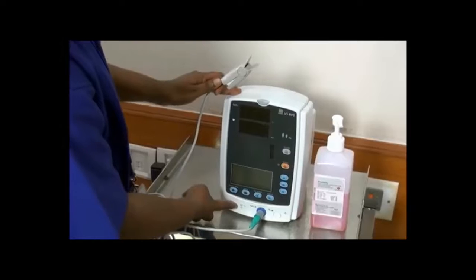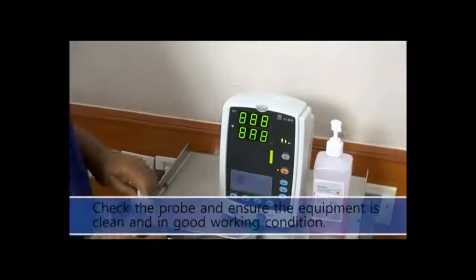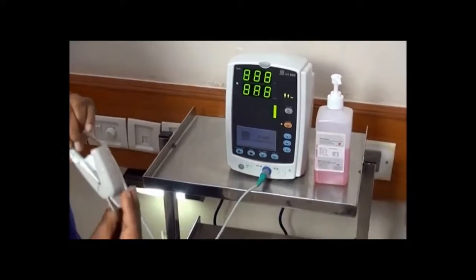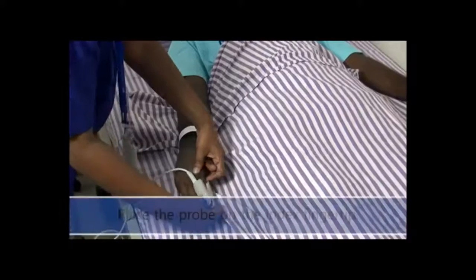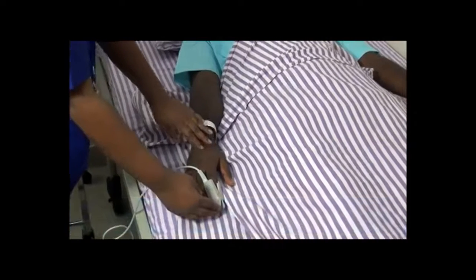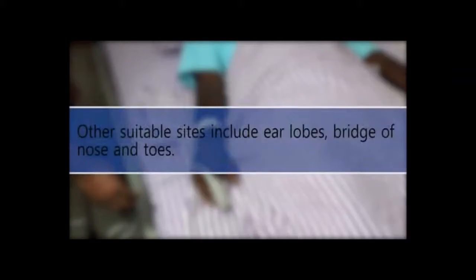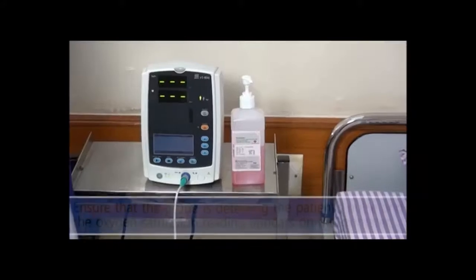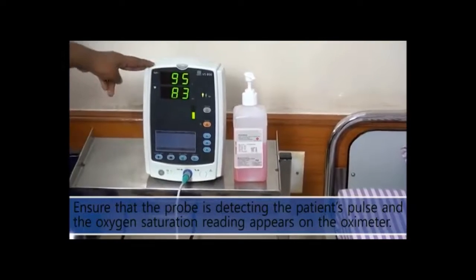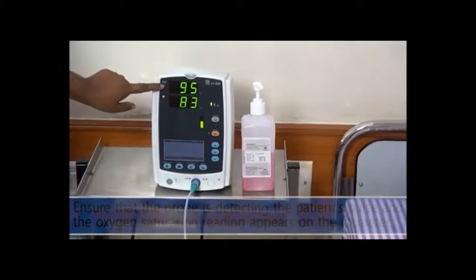Procedure: check the probe and ensure the equipment is clean and in good working condition. Place the probe on the index fingertip. Other suitable sites include earlobes, bridge of nose and toes. Ensure that the probe is detecting the patient's pulse and the oxygen saturation reading appears on the oximeter.